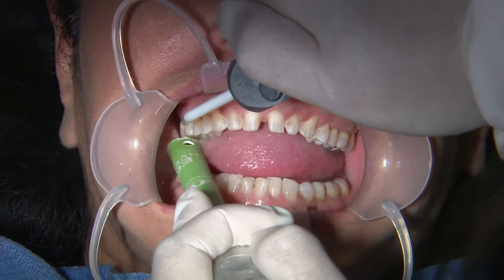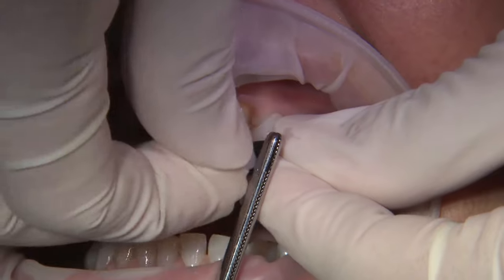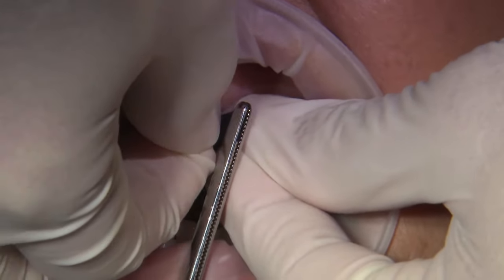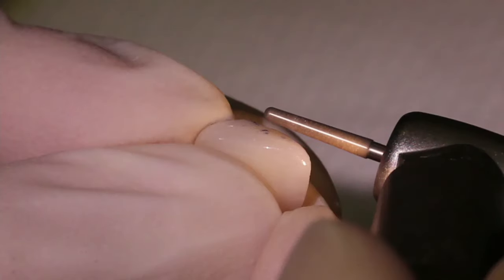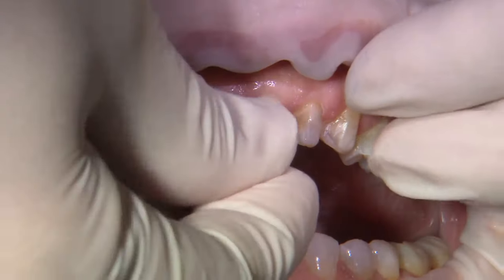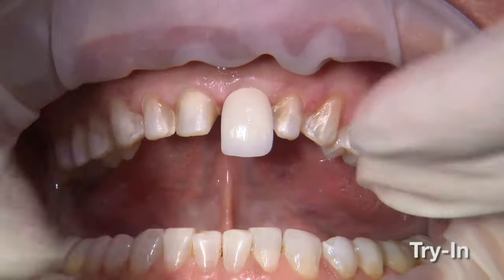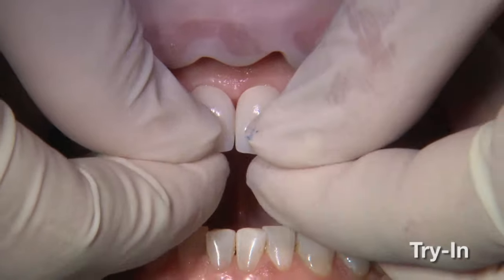It will remove the acrylic without really affecting or damaging the tooth structure beneath. Once the restorations come back, I like using a mylar strip or shim stock to make sure there's good contact between each. You want to ensure that each one fits perfectly down on each prep passively, because with veneers, if there's any slight heavy contact, it will throw off the alignment.